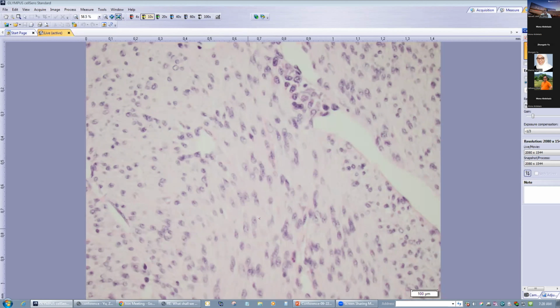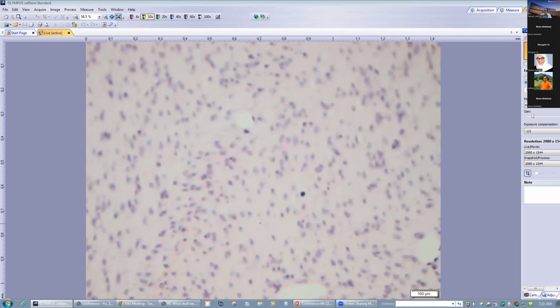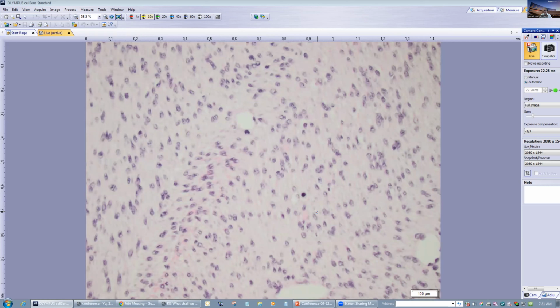As you move around, I'm right now evaluating the tumor, and I would call it very bland, with not much pleomorphism. Let's move around. Scattered mitosis, like this. No necrosis, and the cellularity is not very high. The spindle cells have some collagen. Yes, this looks like a few days old baby, and the normal kidney and tumor intermingle on the edge.